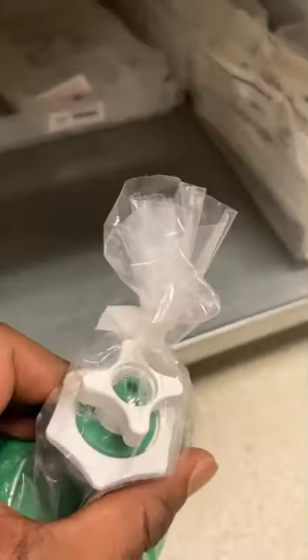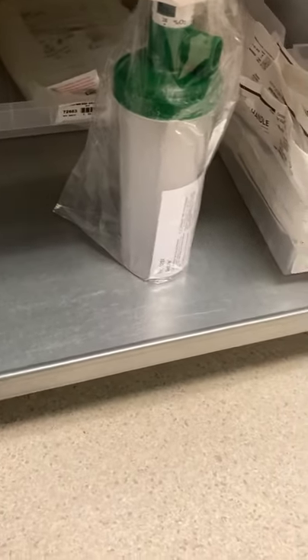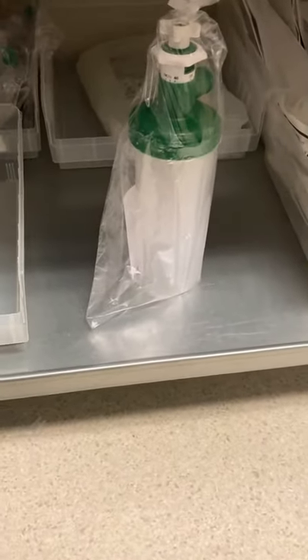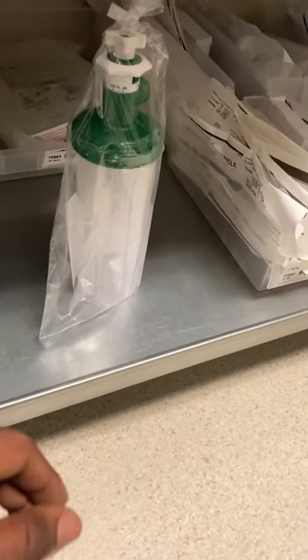This connects to the flow meter. The flow rate depends on the FiO2, but I usually run between six and ten liters. For lower FiO2 — around 28 to 40 percent — about six to eight liters. From 40 to 50 percent, I run about eight to nine liters.